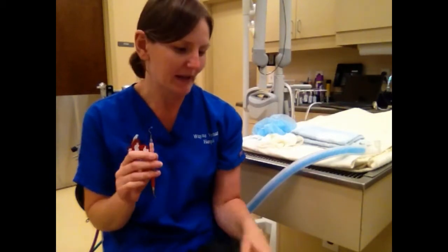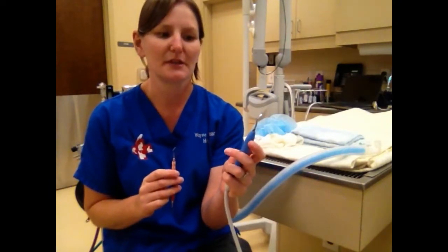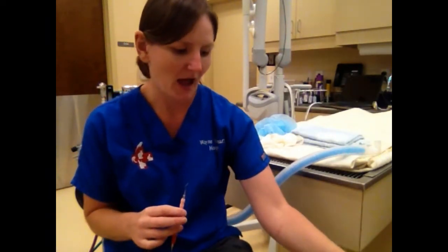Then once the teeth themselves have been scaled, we would work subgingivally to remove the calculus, and we do this using a curette. So this is a manual curette, and it has a blunt tip as opposed to the sharp tip of the scaler, so we use this to get up underneath the gum line to remove the calculus there. We can also use the ultrasonic scaler tip to do this, as it's designed a little bit differently from the manual scaler.